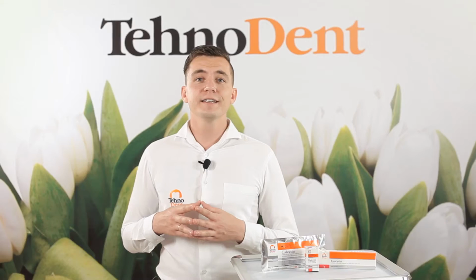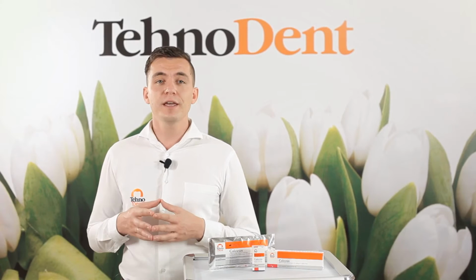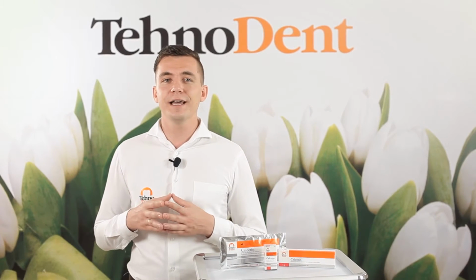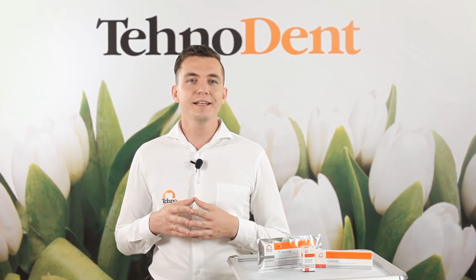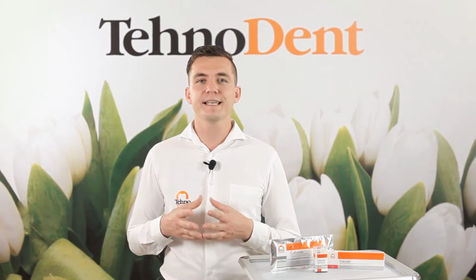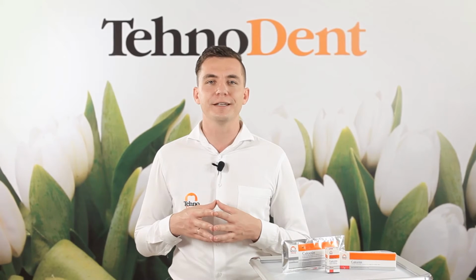For the treatment of chronic periodontitis, after a diagnostic study of the morphological characteristics of the roots of teeth and periapical tissues with the help of X-rays, the mechanical and pharmacological treatment of the root canal should be carried out. The root canal is prepared to put the paste Calcetin for endodontic treatment.